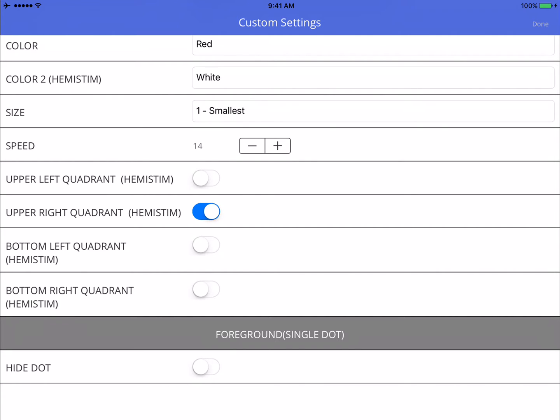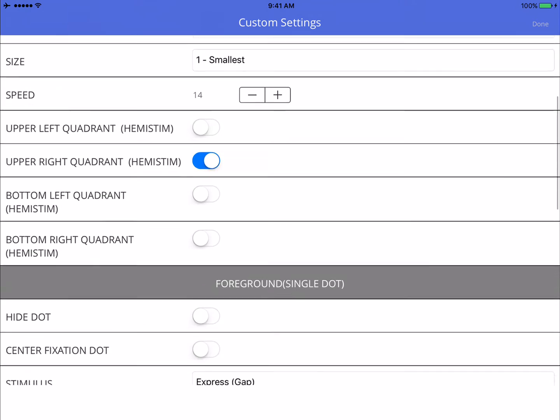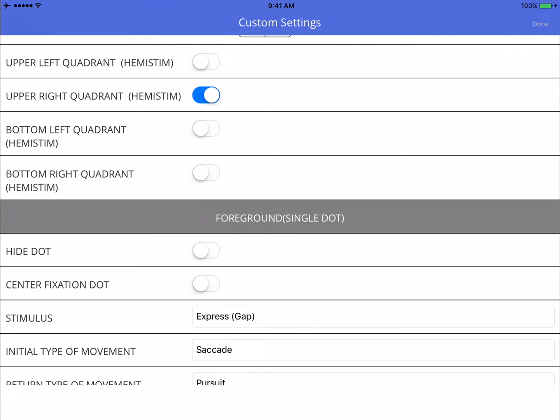And the hemi-stim is going to show up in the upper right quadrant. So the right side for the left brain, upper quadrant is temporal, lower field of view is parietal, upper field of view is temporal. For that reason, I picked the right upper quadrant, and this is appropriate for this patient. I picked a speed of 14.